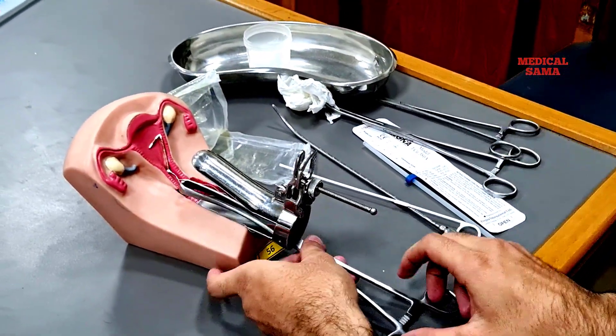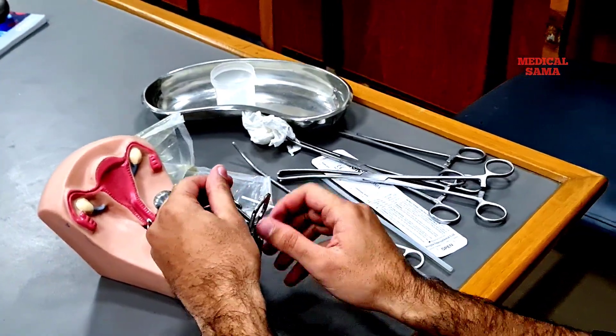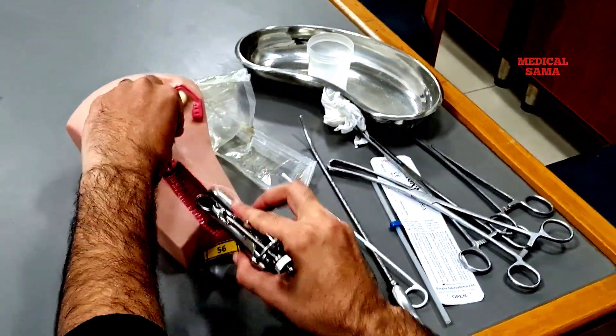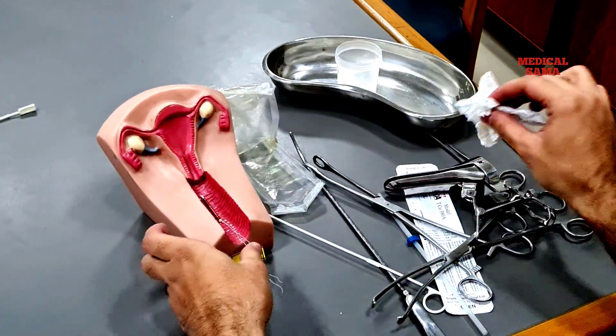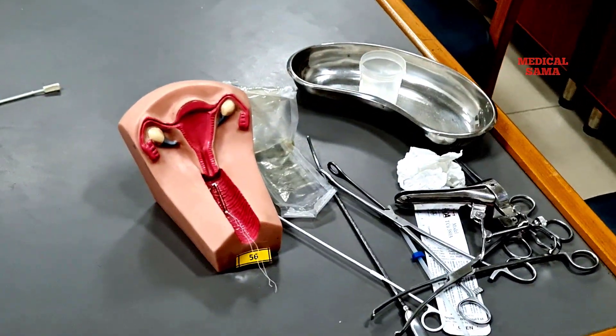After that, remove the tenaculum and the speculum in the same manner, keeping it at 45 degrees. Clean the vulva of the patient, cover your patient, and thank her.